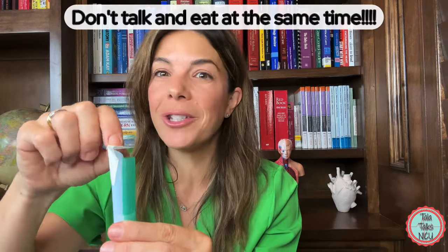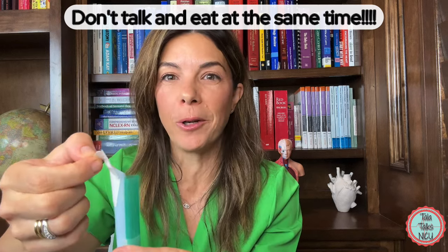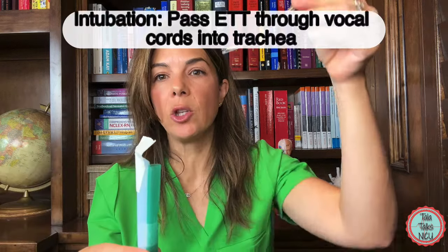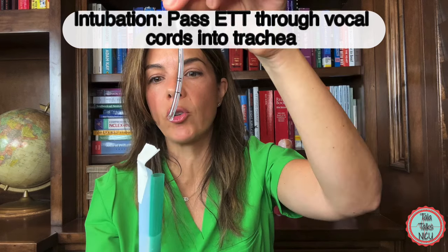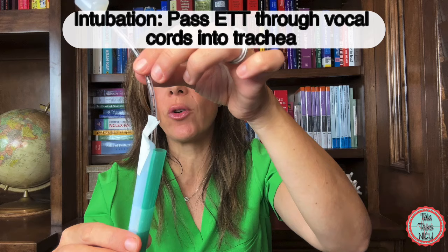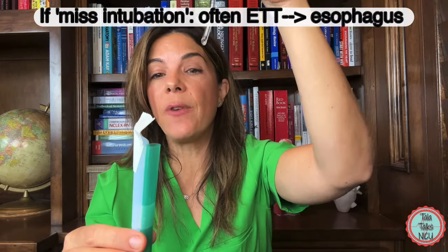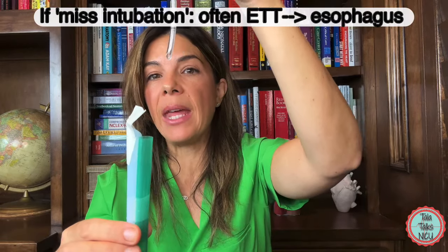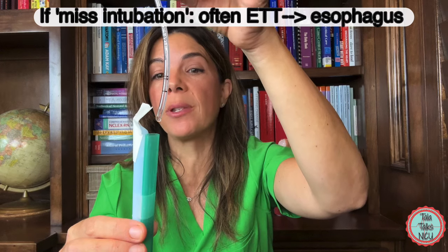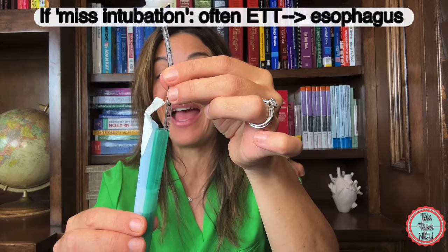That's why you shouldn't talk and eat at the same time, because then the airway would be left open and food could go down the wrong tube. When you're actually intubating, what you're trying to do is pass the endotracheal tube down through the vocal cords into the trachea toward the lungs so you can ventilate. If the intubation goes wrong, very often the endotracheal tube is going too posteriorly and goes down into the esophagus and into the stomach.